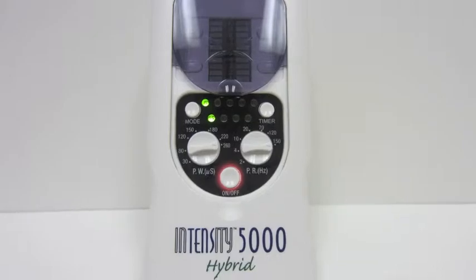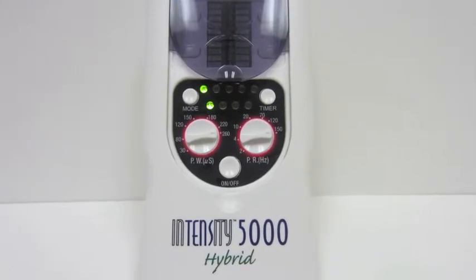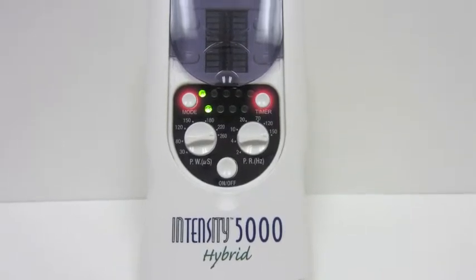Turn the unit on by pushing the on button, then set the pulse width and the pulse rate and select the mode. Then select the time for either 15, 30, 60, or continuous mode.